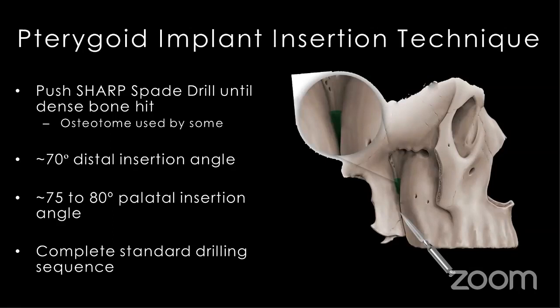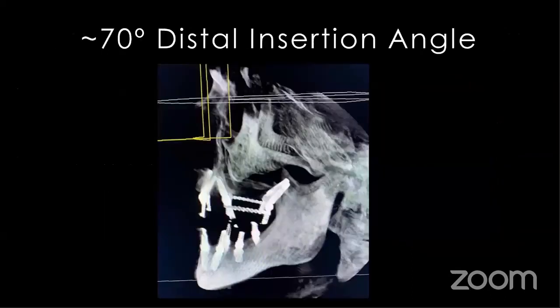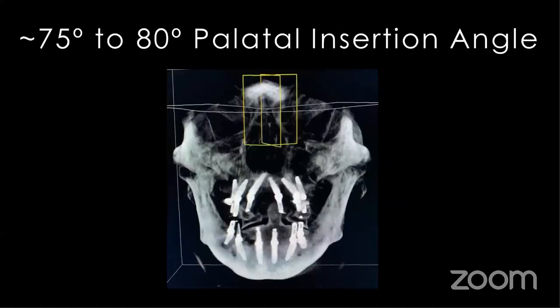So you definitely want to have a proper size osteotomy for the size implant that you're placing, whether it be 3.5 all the way up to 4.2, 4.3 millimeters. So we can see in this CBCT, we have about a 70 degree distal insertion angle, and then the medial-lateral or palatal insertion angle, we can see that it measures close to 80 degrees.